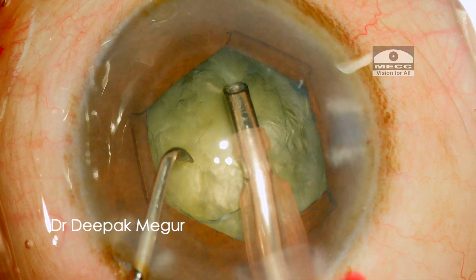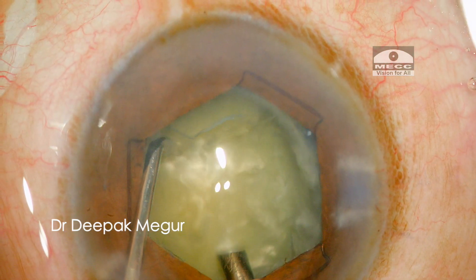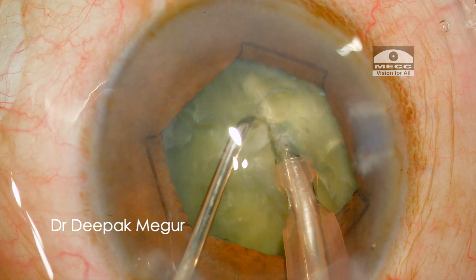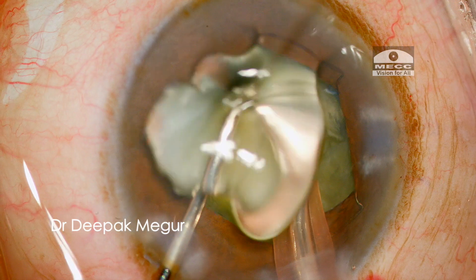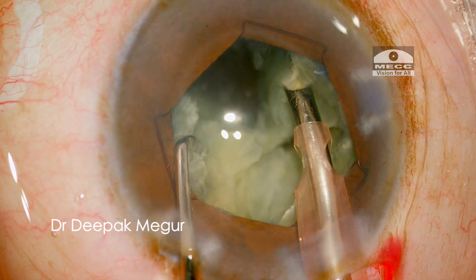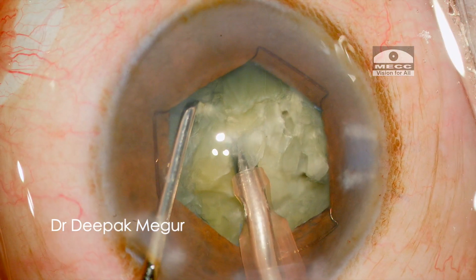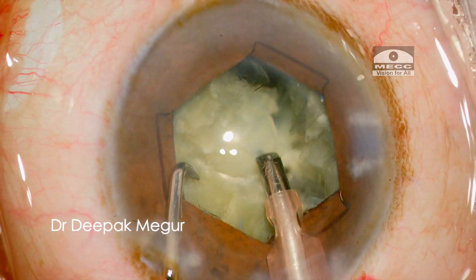Now is the time to perform emulsification of the nucleus. After aspirating the superficial nucleus, the phaco tip is buried into the substance of the nucleus and a vertical chop is performed using a sharp chopper. The nucleus is of ideal density for chopping. Similar manoeuvres of burying and chopping are continued, dividing the nucleus into multiple small quadrants quite effortlessly using this technique of vertical chopping and lateral separation.